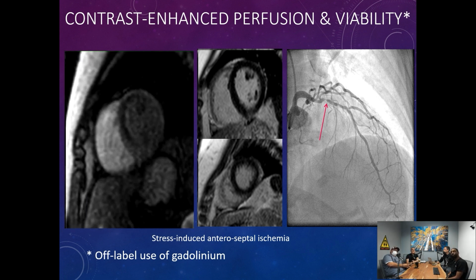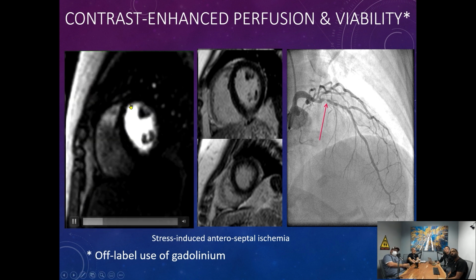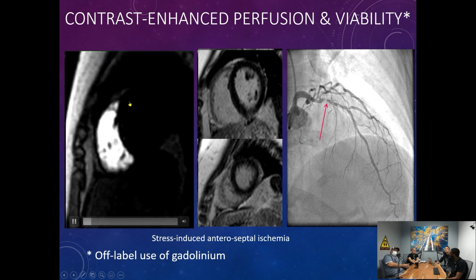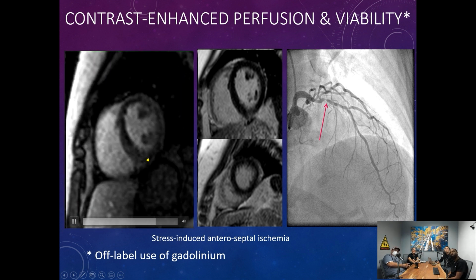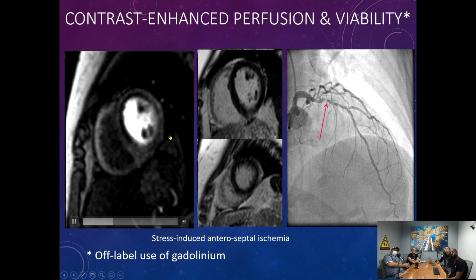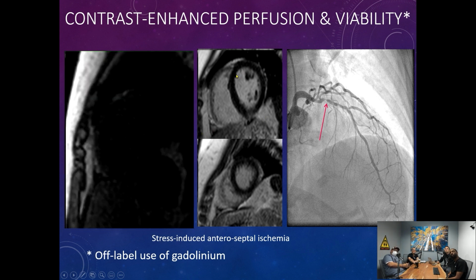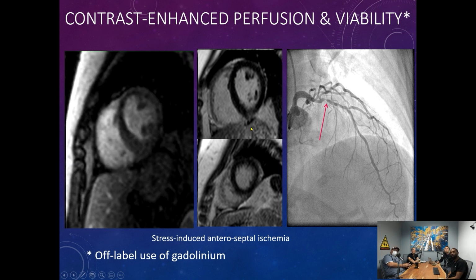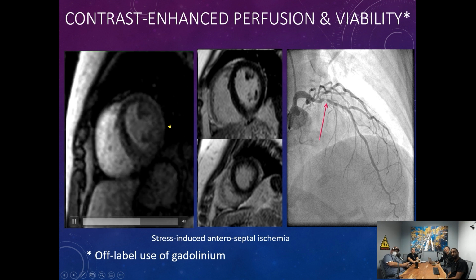They're very safe. And what we see here is there's an area that under-enhances in the anterior territory, whereas you see the perfusion, as Clint was saying earlier, occurs more normally in the inferior and the lateral. These were the images in this patient who then moved on to have late gadolinium images that showed no late gadolinium enhancement. So this patient had what looked like coronary disease without having an infarct.